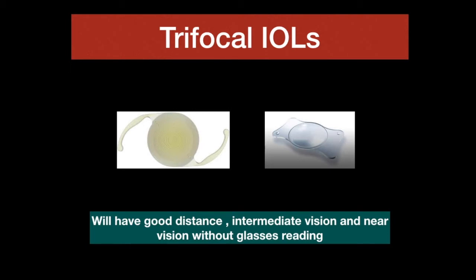One very important point that we must understand, which is different from monofocal for these lenses, is that in monofocal IOLs 100% of the light energy is used for viewing so that they get the best image quality, whereas multifocals divide the light energy proportionately so that there is a slight compromise in the visual quality for the convenience of being spectacle free. With this background, once we have decided to go for any of these IOLs, there are some very important points that you should clearly understand.